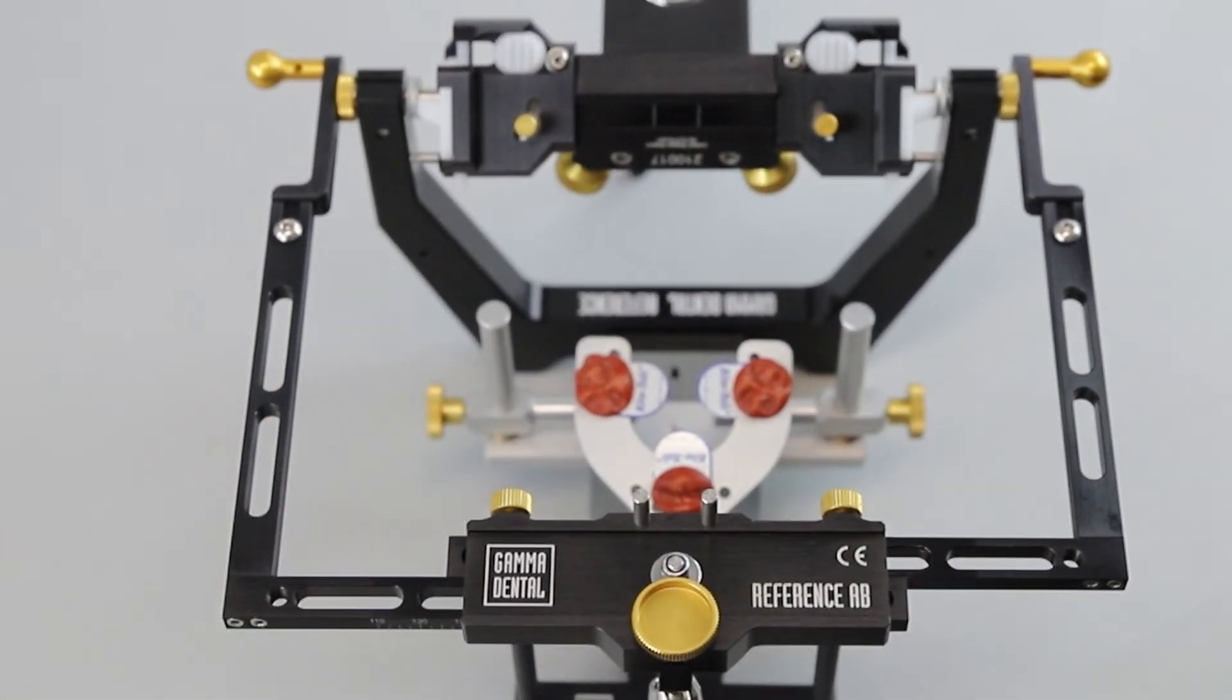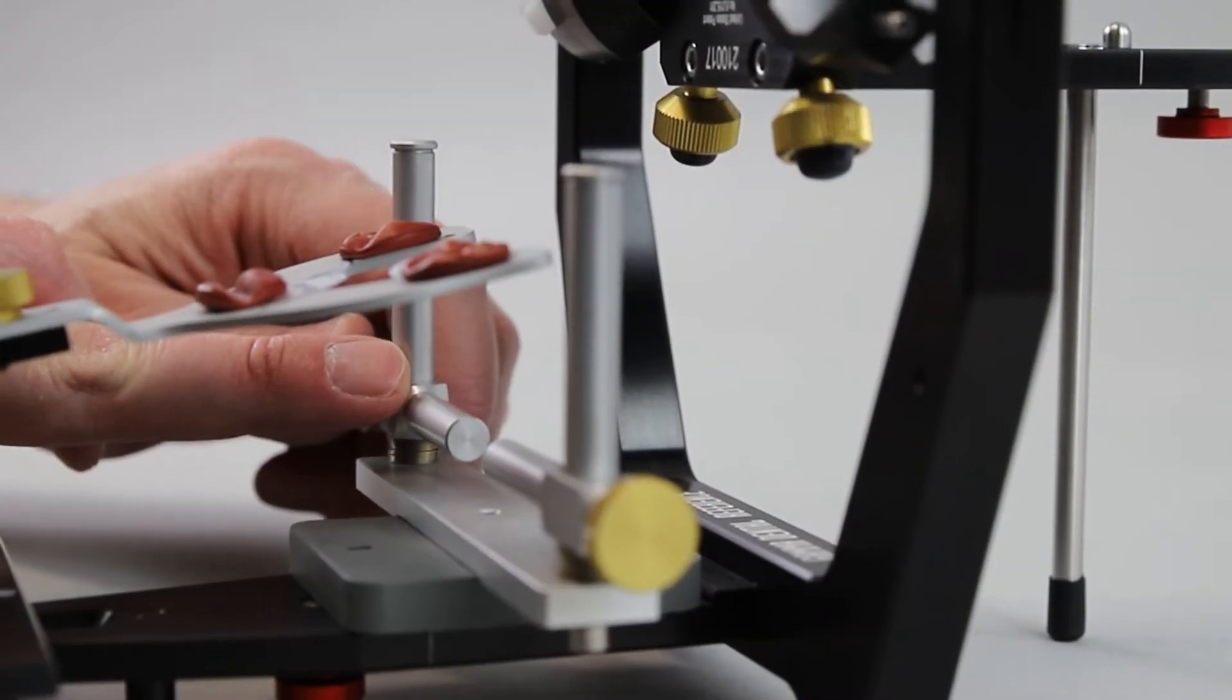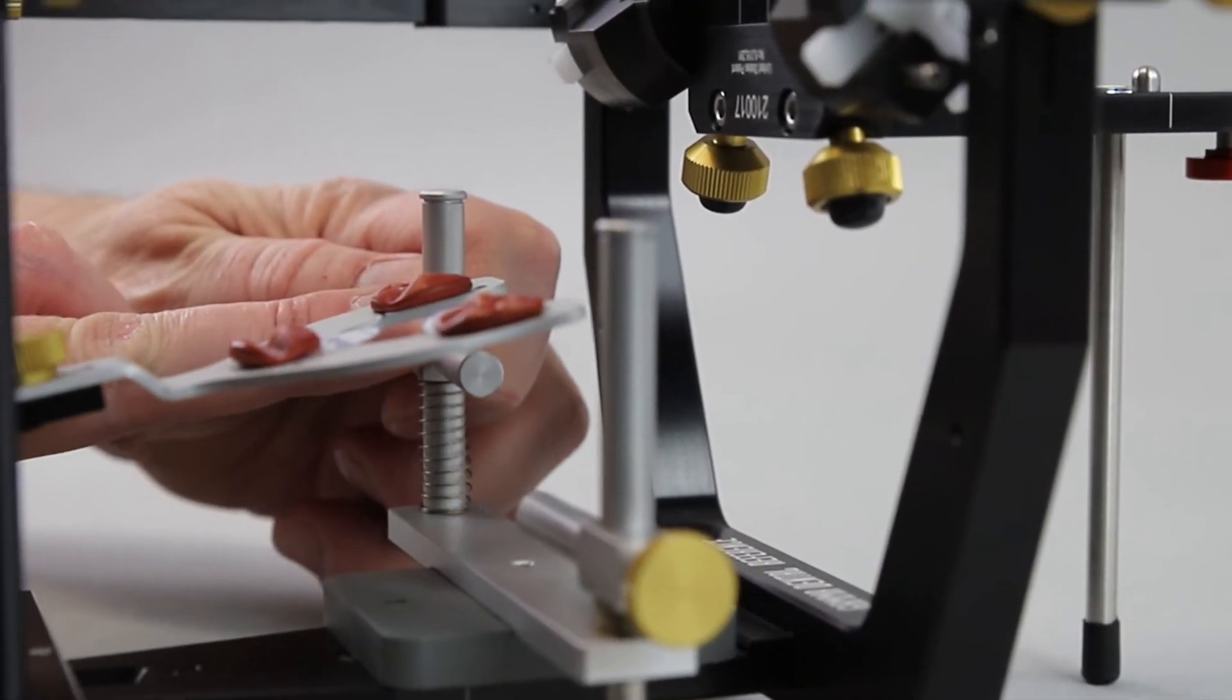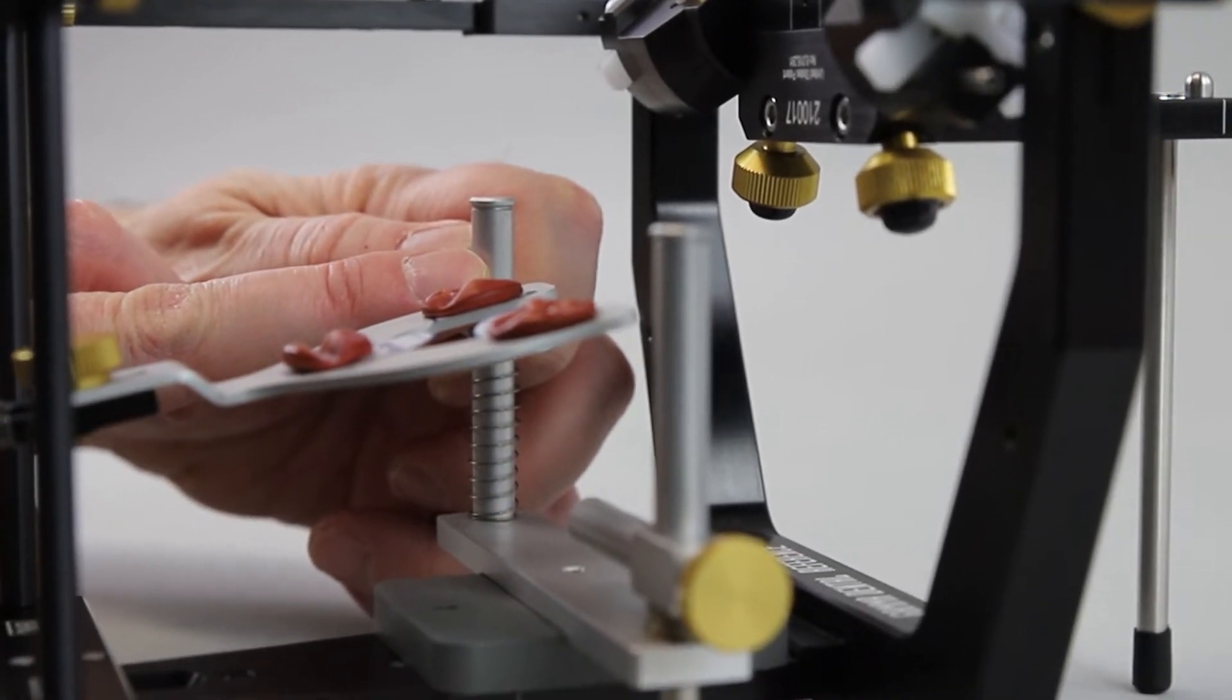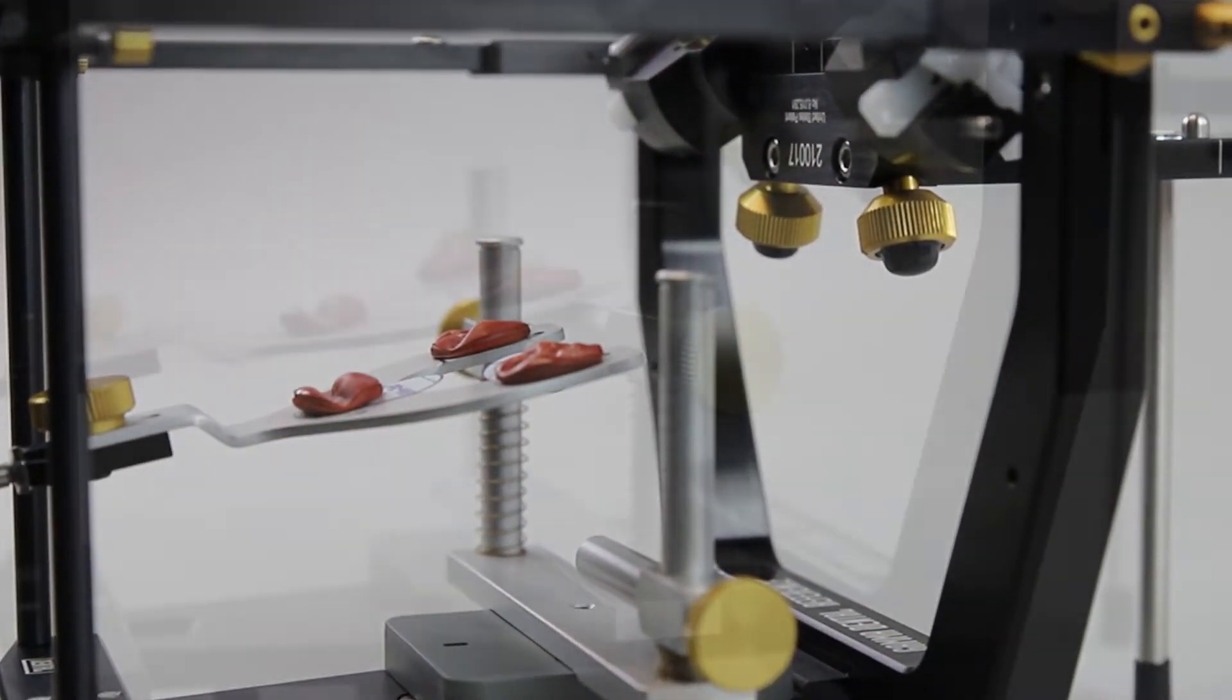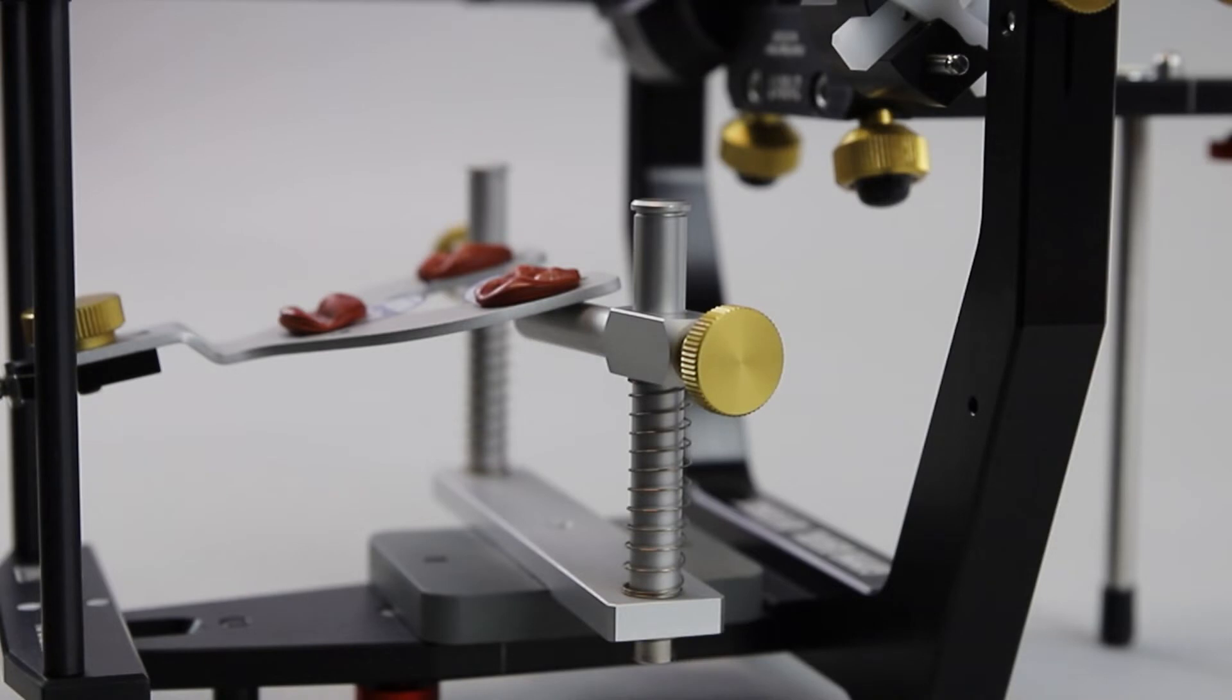Carefully move the bars of the bite fork upwards until they touch the bite fork, then they are fixed. The position of the bite fork must not be changed in this process.